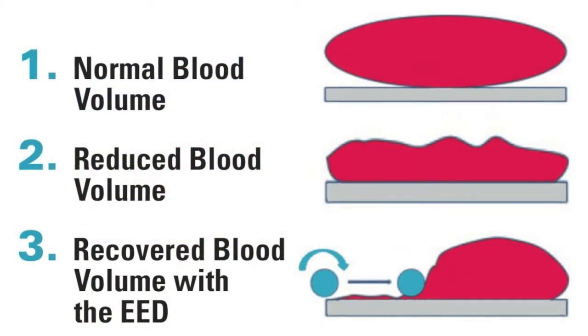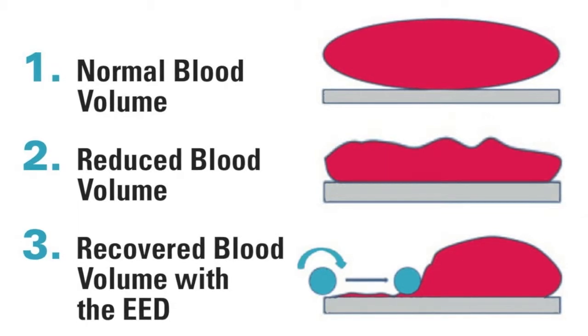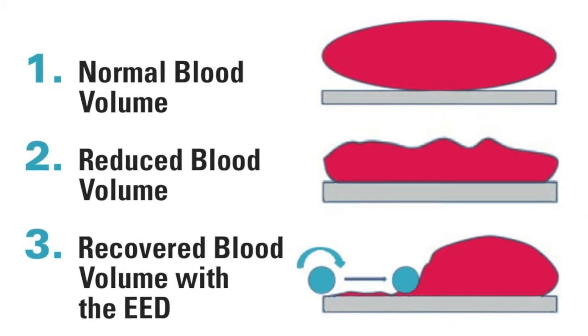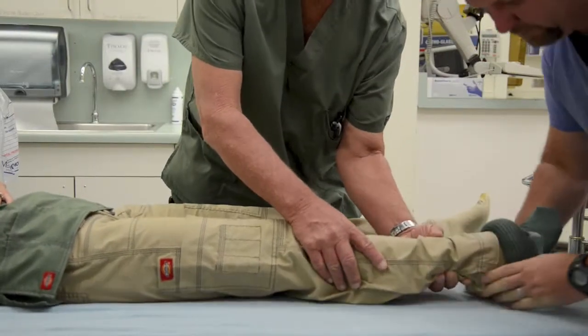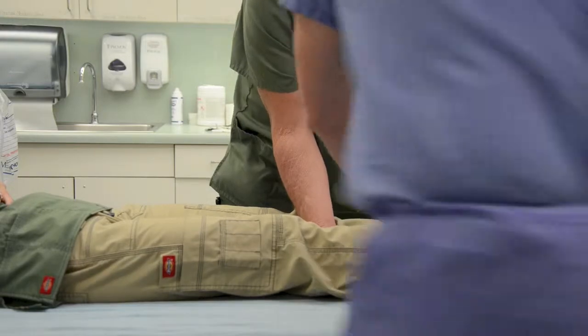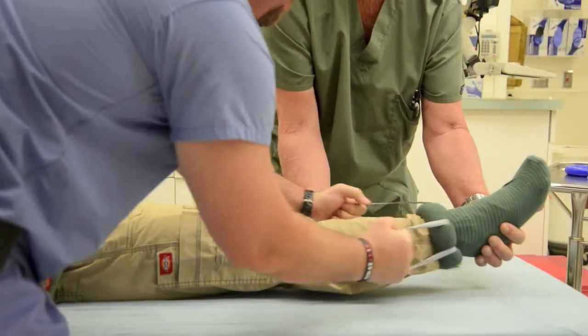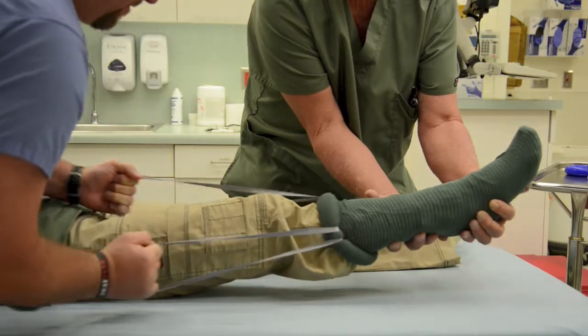When rolled over the extremity, it compresses the veins, arteries, and other tissues and pushes blood and fluid towards and into the core of the body. As the product is rolled up the extremity, the tension on the ring increases to about 160 millimeters mercury. This will occlude most arterial blood flow. It also moves the blood out of the venous system into the core.